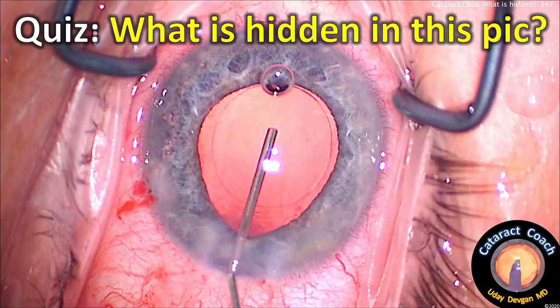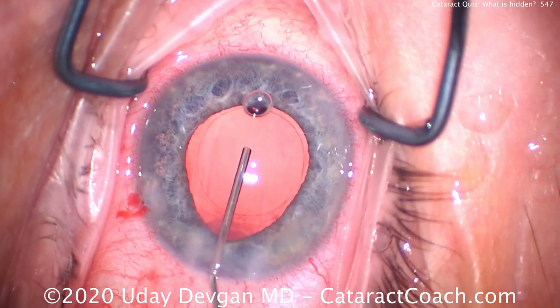Cataractcoach.com quiz: what is hidden in this picture? Look carefully — you can see it. It's not easy. Let me show you.